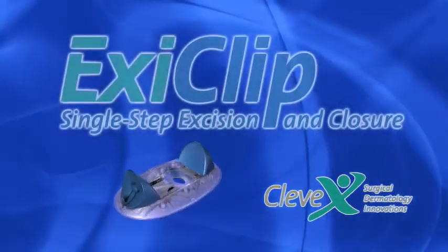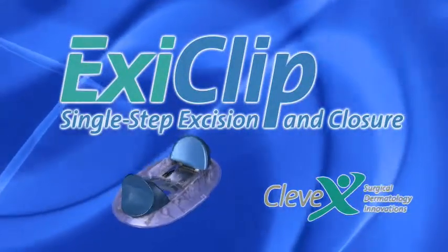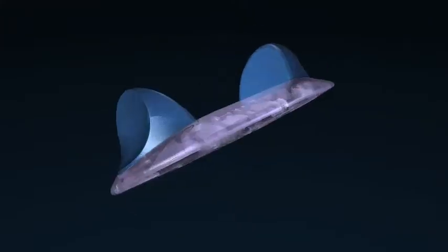Clevex is proud to announce the introduction of the ExeClip, an FDA-approved, innovative skin biopsy closure and repair instrument designed to provide distinct benefits to dermatological professionals in the clinic, office, and hospital.